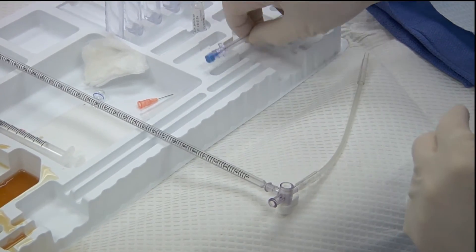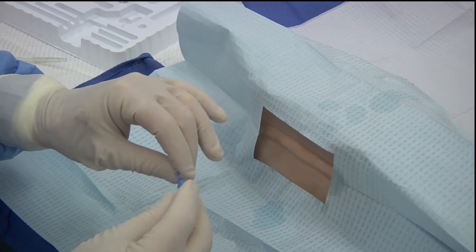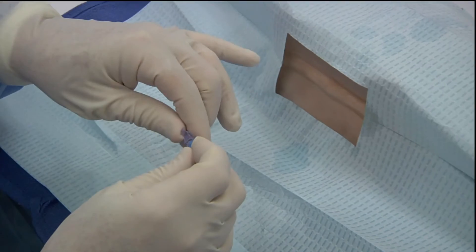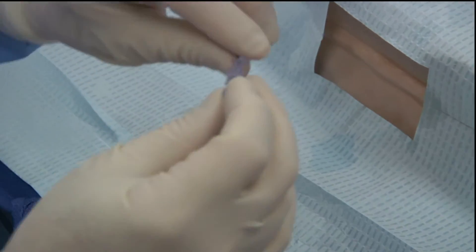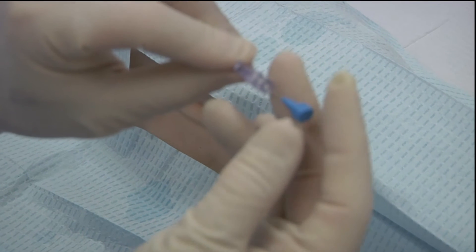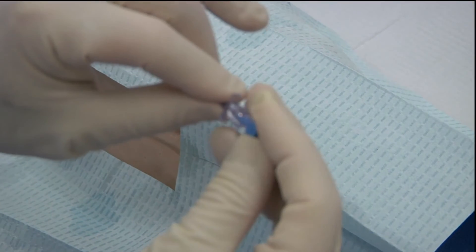Once you are ready to begin the lumbar puncture procedure, with the lumbar puncture needle it's important to get the bevel of the spinal needle in the right position. There is a small clicking mechanism on the stylet that ensures that the bevel on the needle is facing upwards towards the top of the head. This has a little dot and this dot lines up.